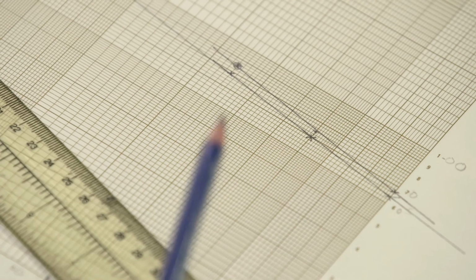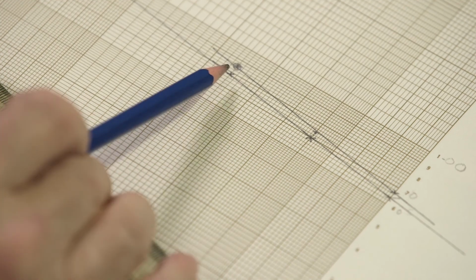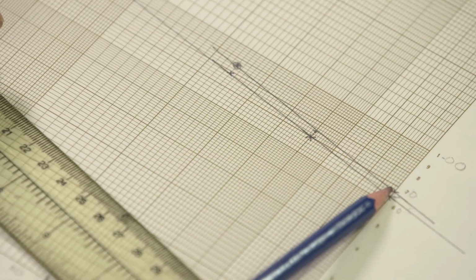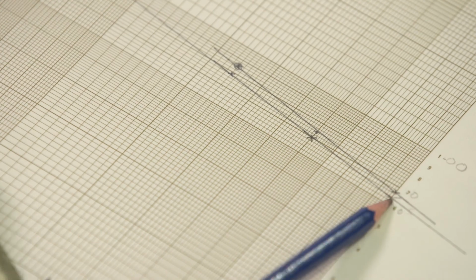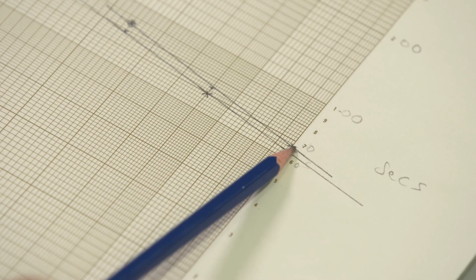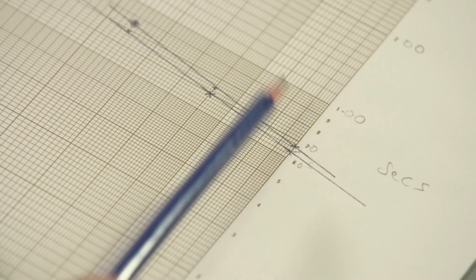Now we need to make a comparison of the relative concentration. What is the concentration in the IQC relative to the reference or standard line? How do we do that? We look for the point where the straight line through the IQC material cuts through the 100% line. Of course, it's on or close to that clotting time if the assay has been successful. It may not be exactly on that clotting time, but it's normally very close to it because we've got a straight line and parallel relationship. So we need to know which is the clotting time here where the IQC line cuts 100%.